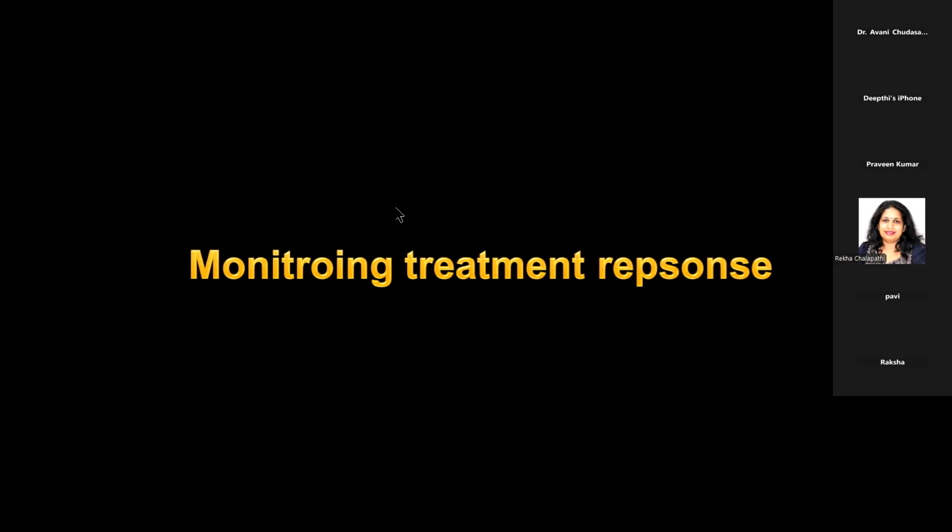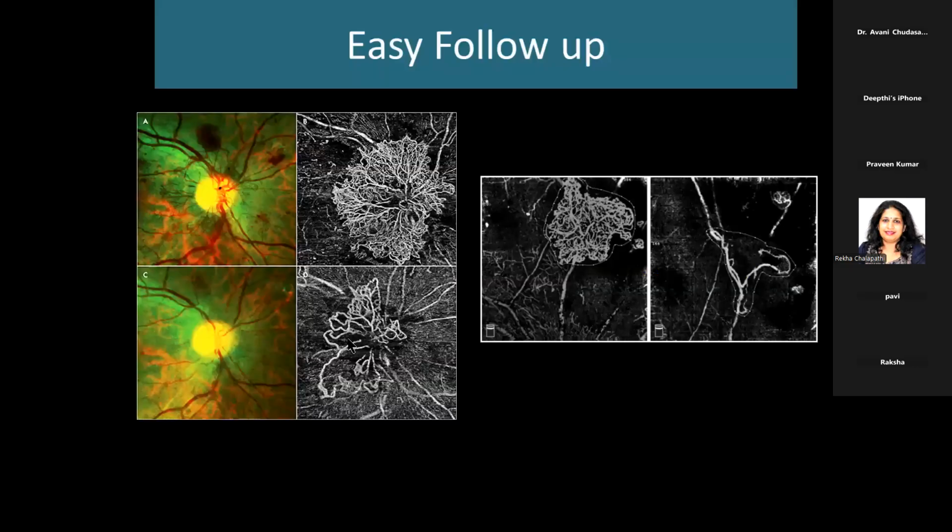This is the pre-treatment neovascular network. This is the post-treatment. You can clearly see how the caliber of the vessels has reduced and the network has reduced. So you can easily, non-invasively, follow up these patients.